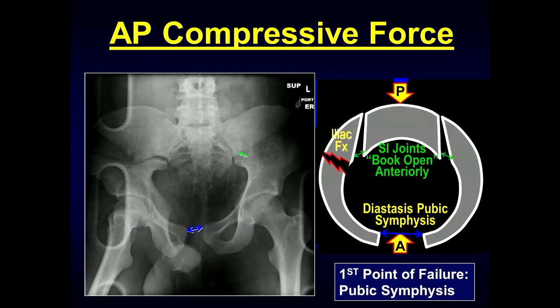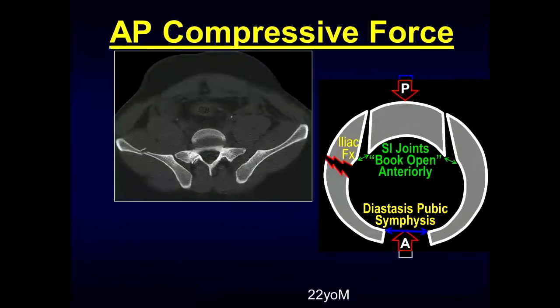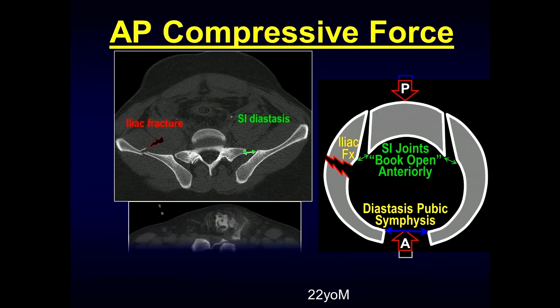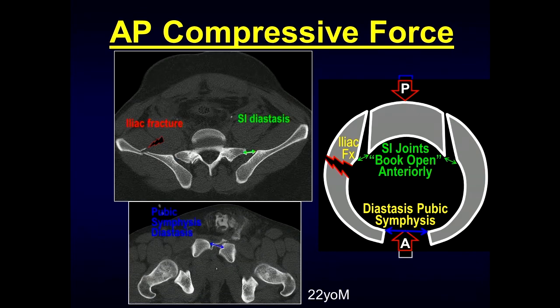On CT acquisition we can see the SI joint diastasis, the fracture of the right iliac wing, and more distally the pubic symphysis is widened. We also have extravasated contrast representing a soft tissue injury — in this patient, they had a bladder rupture. There are three different types of AP compression injuries. The first involves vertical pubic rami fractures and symphysis diastasis less than 2.5 centimeters.